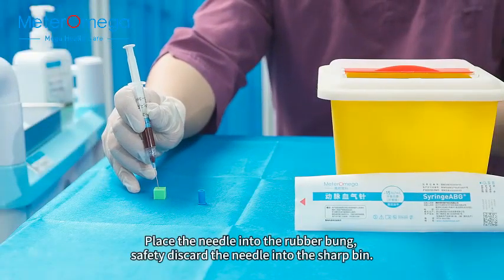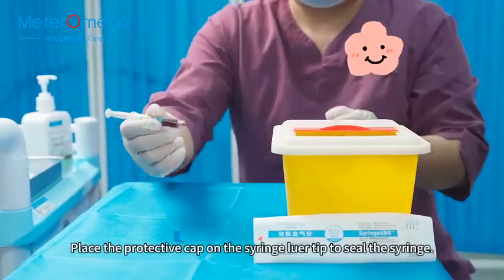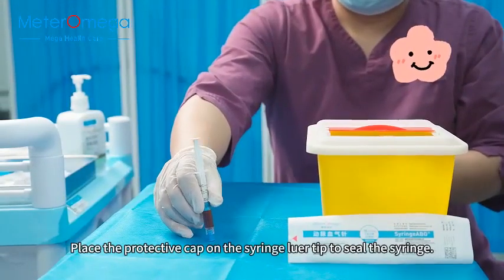Place the needle into the rubber bung. Safely discard the needle into the sharps bin. Place the protective cap on the syringe luer tip to seal the syringe.